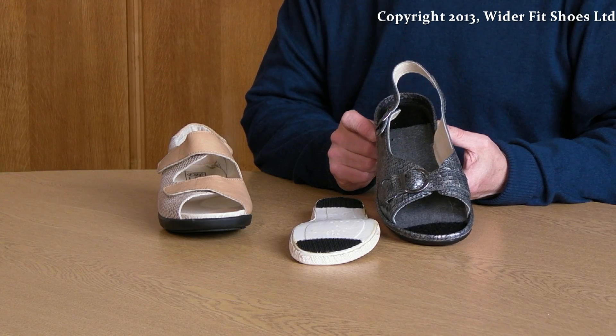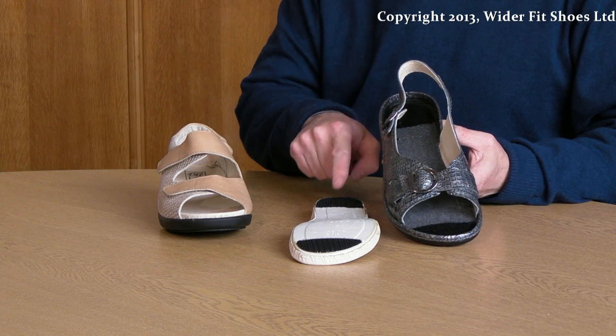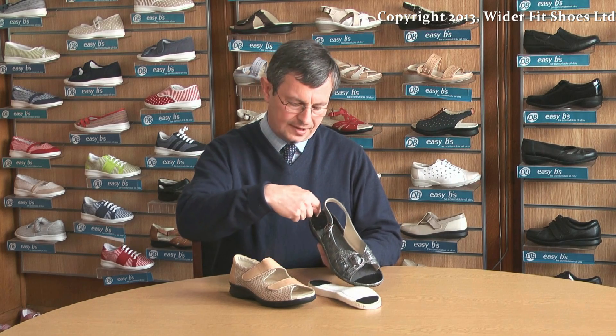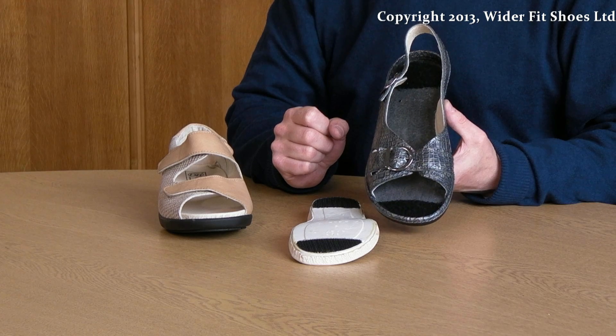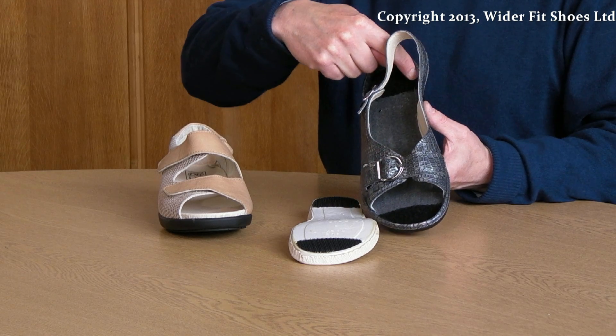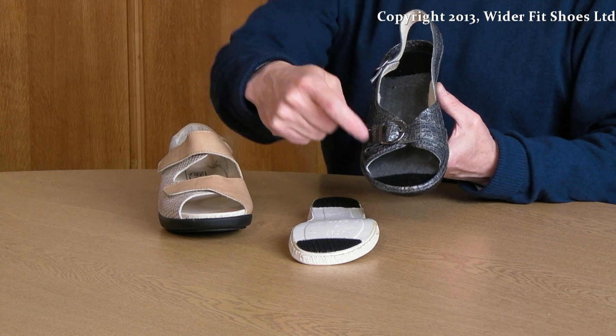The sock is attached to the shoe via a hook and loop fastening system. When the sock is removed, a cavity is left for the insertion of an orthotic. The new orthotic can be fixed to the sole of the sandal using a hook and loop fastening system.